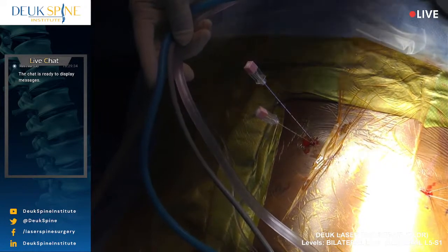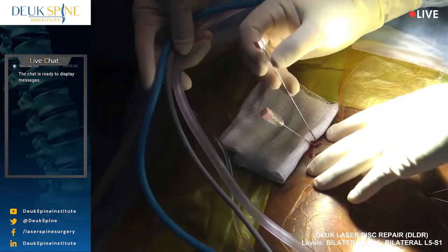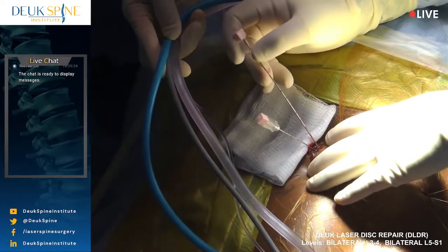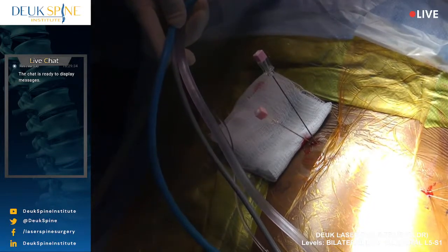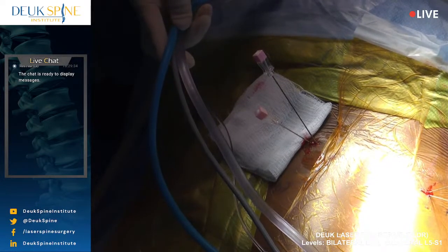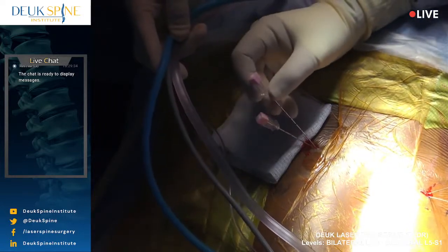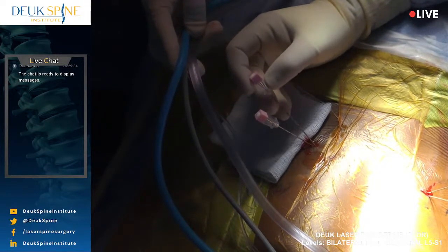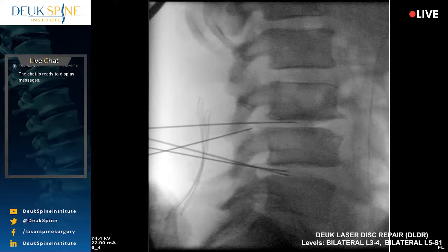Why does that look like we're coming from a lower position? Doesn't it? Yeah. But we're really not. It's really the same. I want to go through the same incision. You okay? I mean, could we be off that much? Can't possibly be. I'm just amazed at the trajectory that it appears to be taking. I can feel the herniation. I'm bouncing off of it. AP?